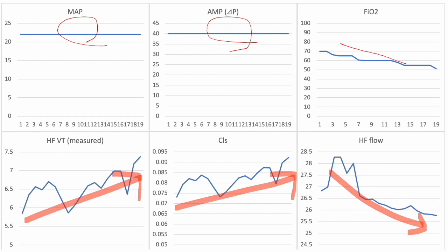The relationship between the pressures supplied by the ventilator, lung compliance, and the tidal volume varies based on the lung dynamics. This relation is the same in HFO. The change in compliance and tidal volume as respiratory status improves is a very important change to monitor.